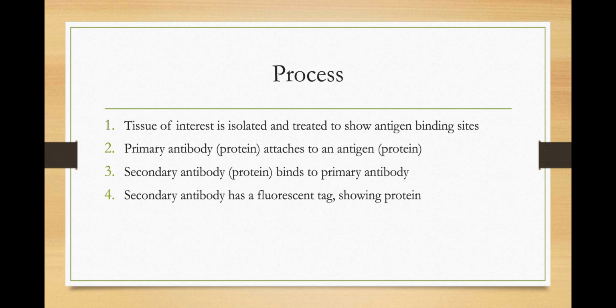Both antibodies and antigens are proteins, therefore showing the prevalence of such proteins in a tissue. Antigen binding sites are specific for an epitope or shape of the antibody. Only the specific antibody can bind, resulting in the target protein being revealed.